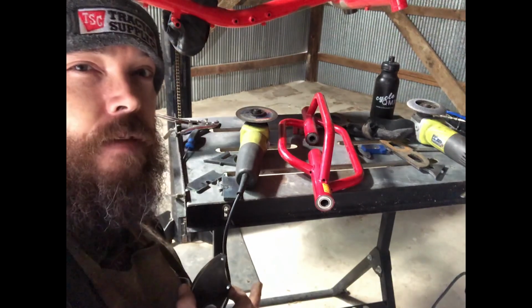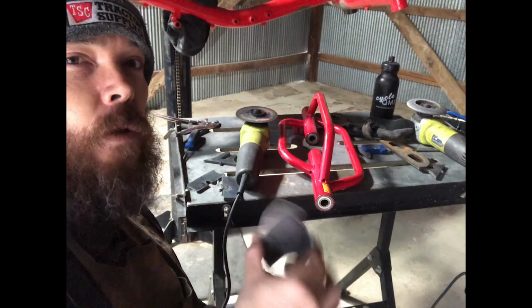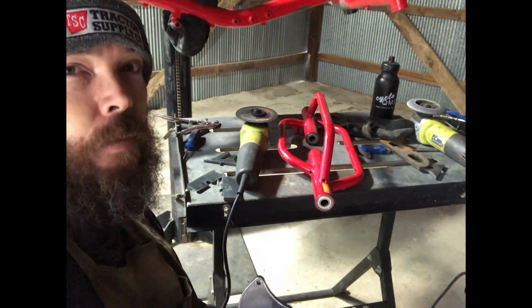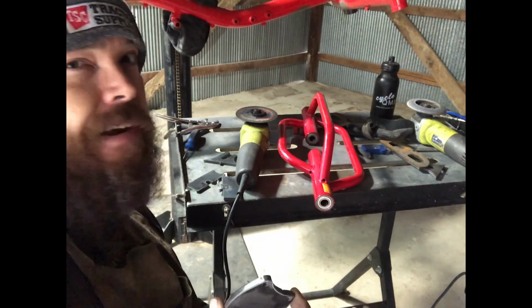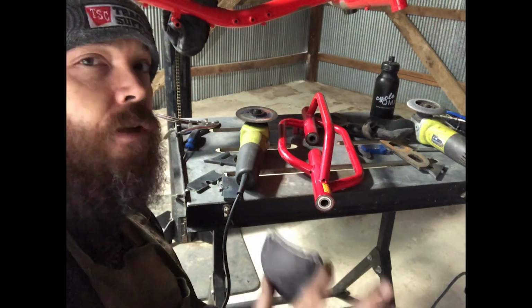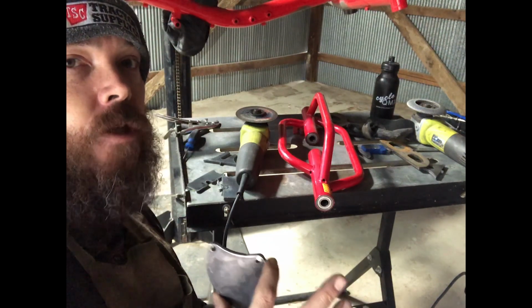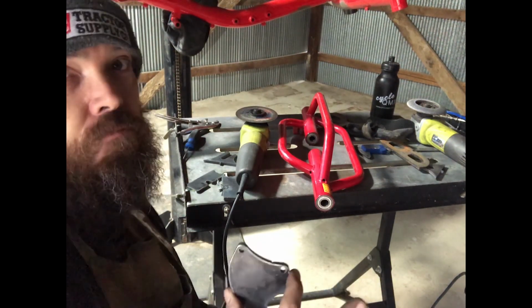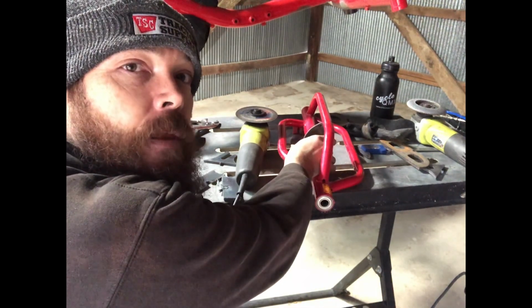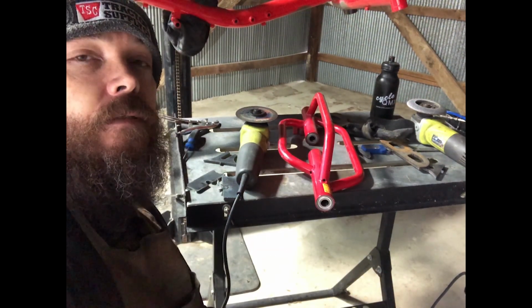I guess you could do that on this as well, since with the one wheel drive, actually only one wheel is turning, and that one wheel is the only wheel that's locked to the brake. So the other wheel pretty much doesn't do anything. So I guess technically you could put disc brakes on both sides, regardless if you're running posi differential or just a single wheel drive. Keep that in mind, future nailers. For today, I'm gonna put mine on the inside, and I'm only gonna have the one wheel drive. Got it? Keep it posted.